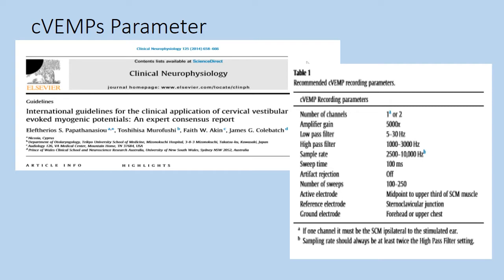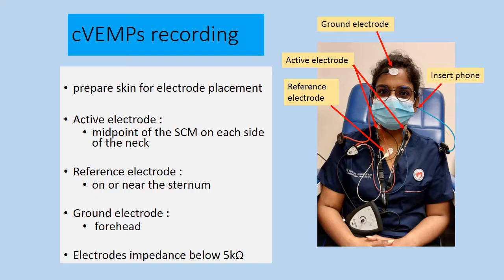This is a published article reported by Papathanasiou et al., regarding the guidelines for the clinical application of cVEMPs, which we can refer to in preparing the system setting for cVEMP recording.